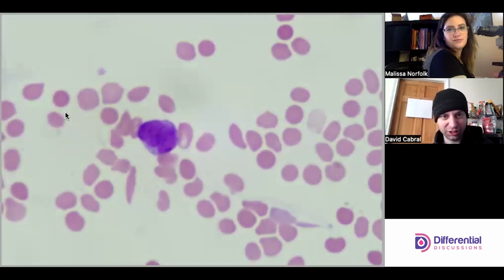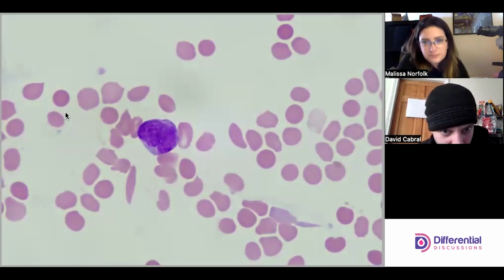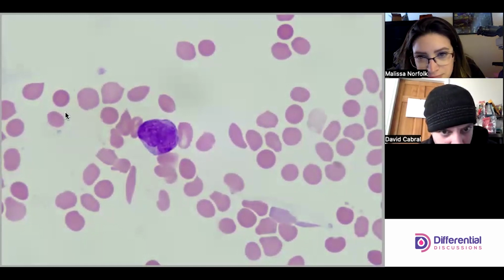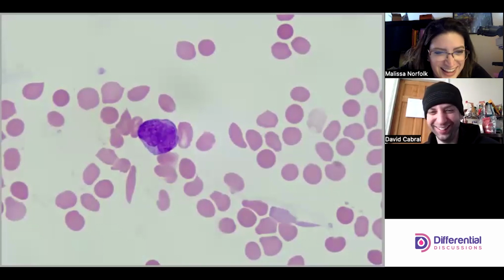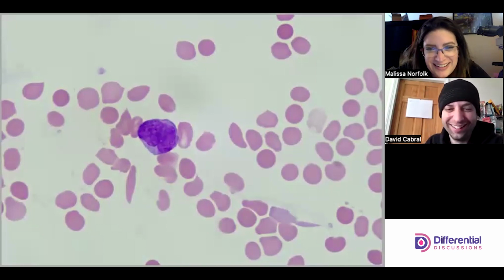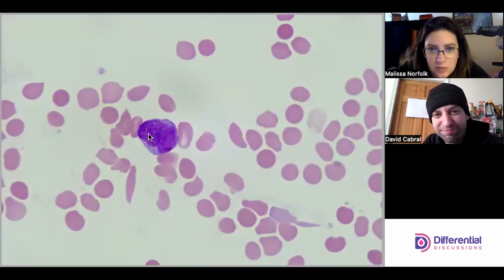So this looks like I see two distinct kind of lobes. It looks like it's coming up here, and then it almost looks like it goes like this. Little fold. It's still plausible it's a mono horseshoe. But it's abnormal and it's got nucleoli.